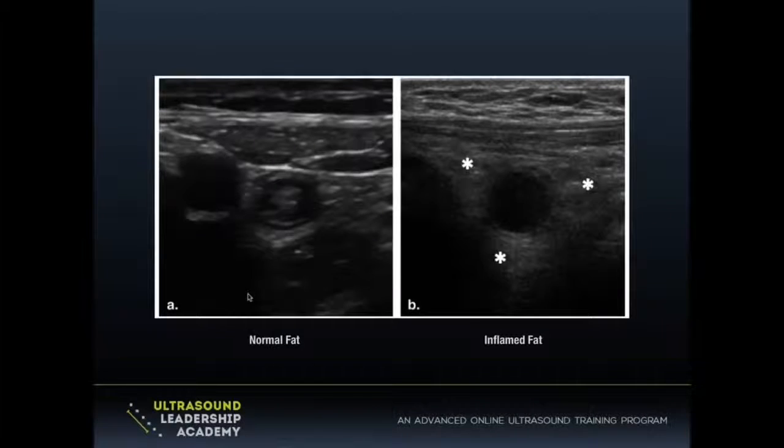A couple of other nice tips when you're trying to make that diagnosis. Say maybe the appendix is 6.5 millimeters, and you're thinking to yourself, well, I don't want to overcall it just because it's a little over 6, but it's not like a slam dunk acute appendicitis. Other things can help push you to make the diagnosis, like the inflamed fat around the appendix here. So we often see this fat stranding around the appendix on ultrasound, where you actually get edema of the fat around the appendix.